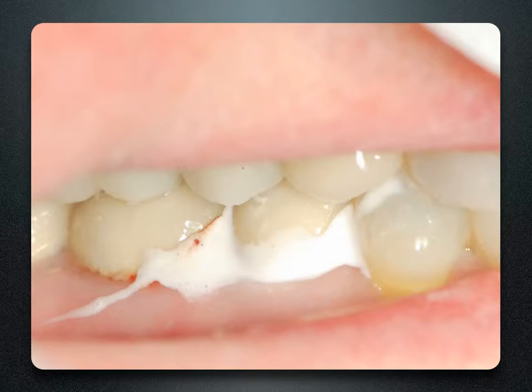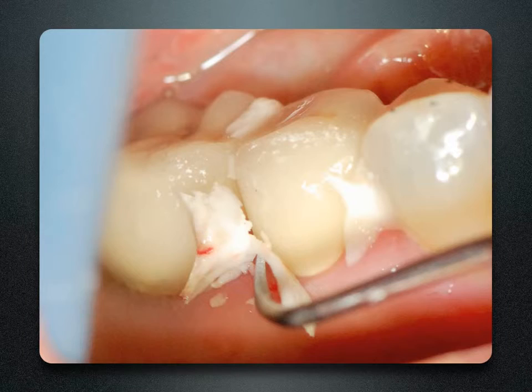One day I'm cleaning up cement on a patient, and as I take a scale of the cement, I realize that this big chunk of cement really looks like an anatomic wedge placed from the buccal and lingual. Then a light bulb went off in my head — that would make a really nice anatomic wedge that would prevent the matrix band from being crushed in that wide open box with that missing cusp.